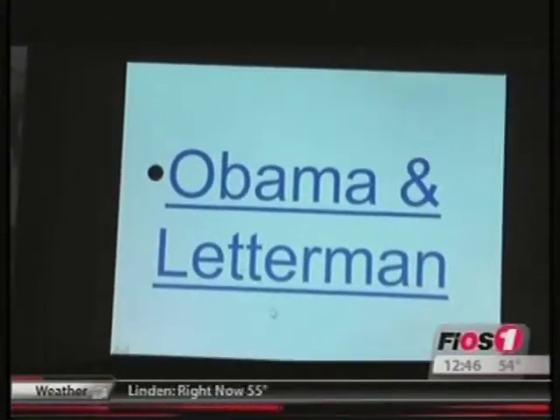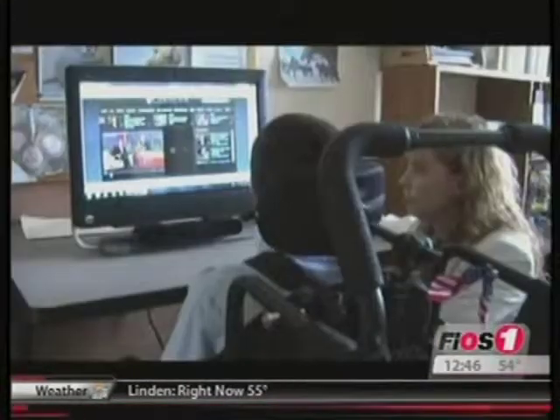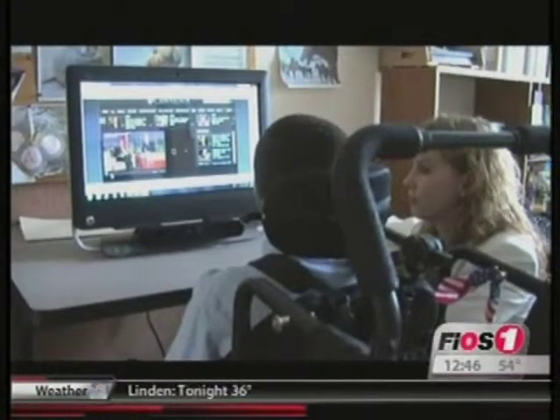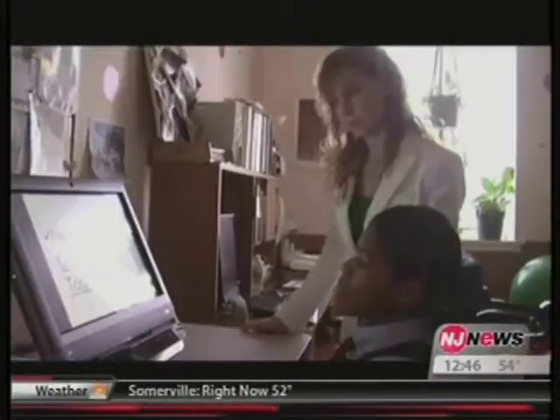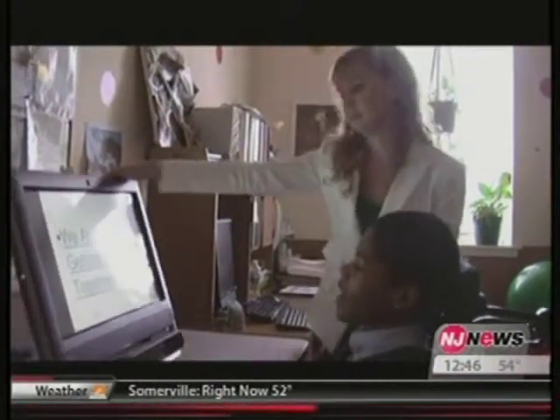There's two different methods. Lee was using dwell, where he had to keep his eyes focused on one fixed point for a predetermined set amount of time. We've also worked with blink, which is using an eye blink to make a mouse click. Instead of keeping your eyes on one place, you have to blink your eyes.